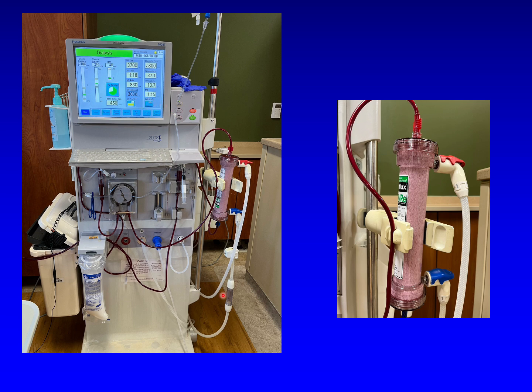Note that with both acute dialysis and CVVH, typically a dual lumen venous catheter is used for vascular access, so the blood lines to and from the patient are actually both venous blood, but they're labeled arterial and venous so that we can be sure they are hooked up in the correct direction to the dialyzer, and also so that we know which line is returning blood to the patient, because that's the one we want to put our meds into, like EPO, vitamin D, and antibiotics, so that they won't immediately be removed by dialysis.